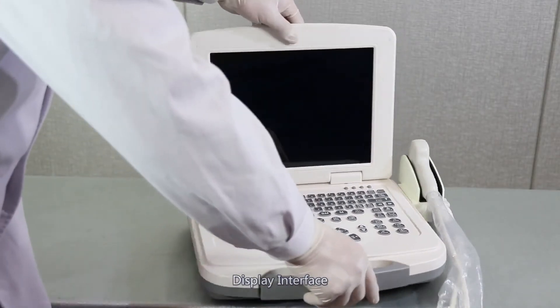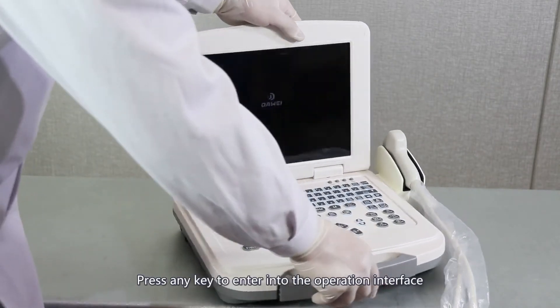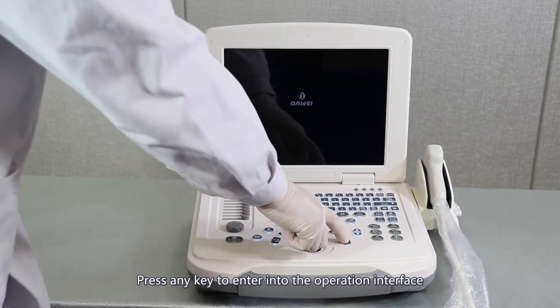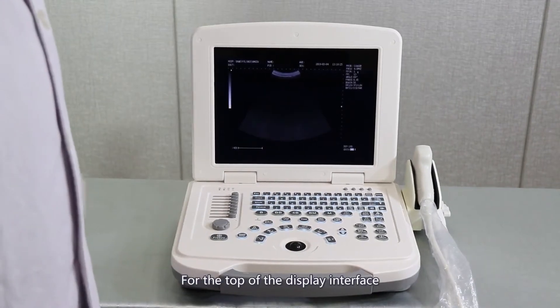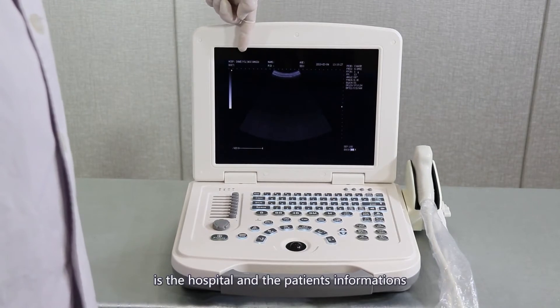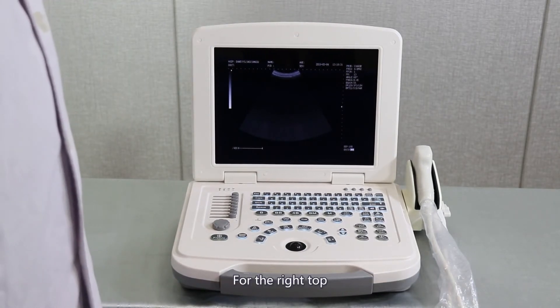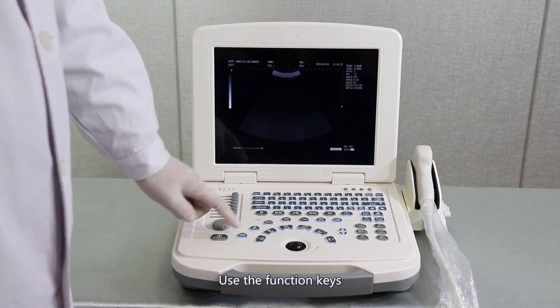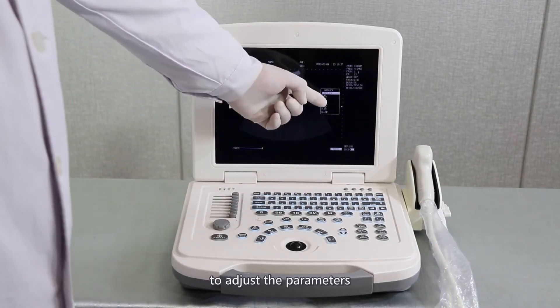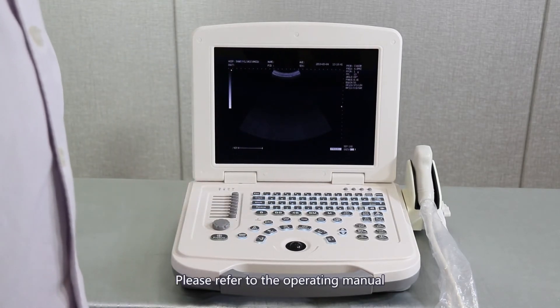Display interface. Turn on the power switch on the left of the machine. Press any key to enter the operation interface. At the top of the display interface is the hospital and patient information. At the right top are the current parameters. Use the function keys to adjust the parameters; please refer to the operating menu.